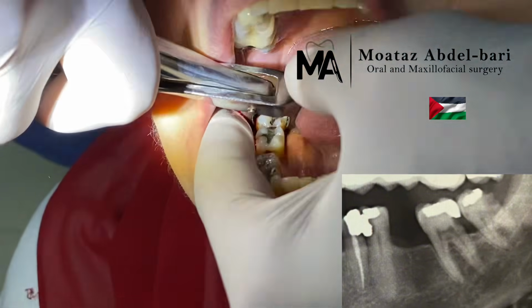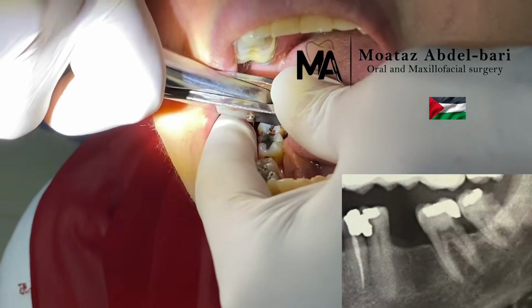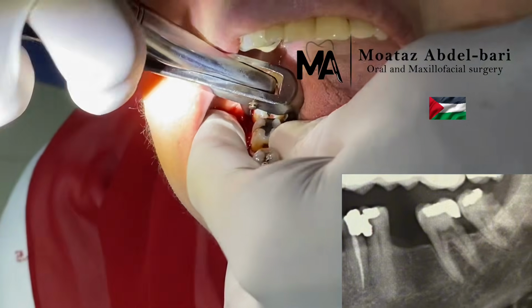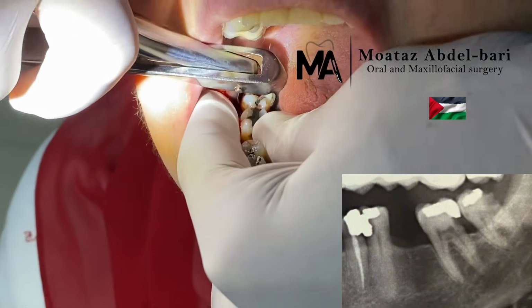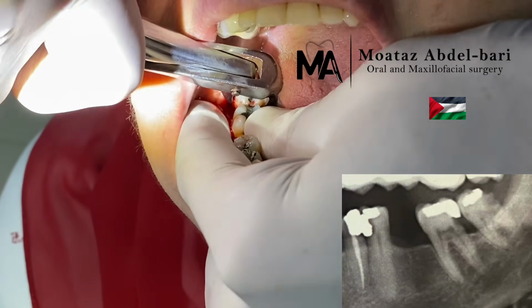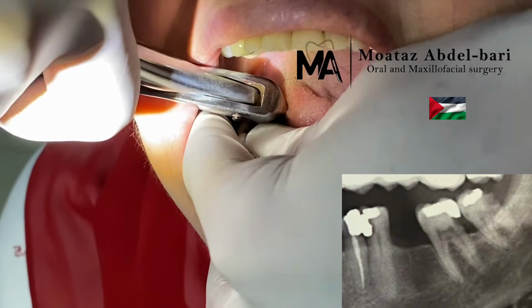I hold the tooth along its long axis, mesially tilted. I try to luxate with apical rotatory movement, deep wedge, and push the top of the forceps with the thumb of my non-dominant hand to take a deep grip. But I felt resistance at this moment. I feel resistance, so I decide to stop working with forceps and shift to the elevator.